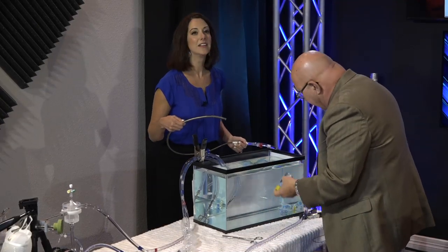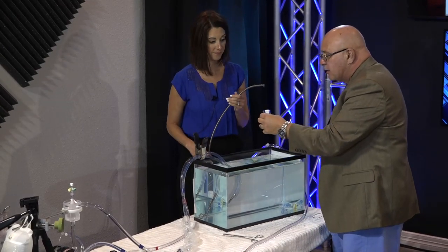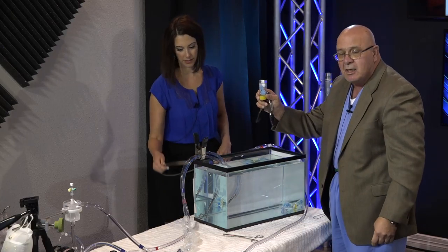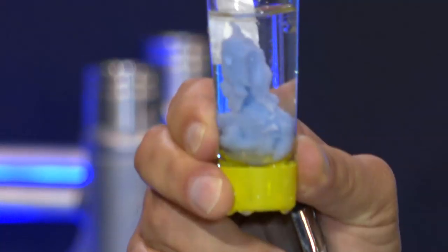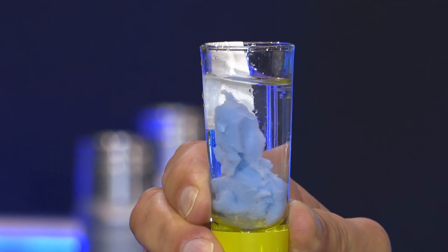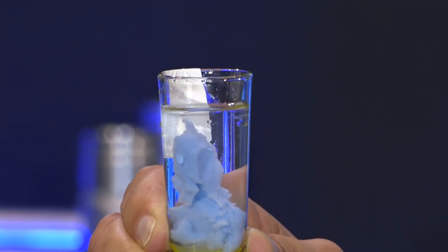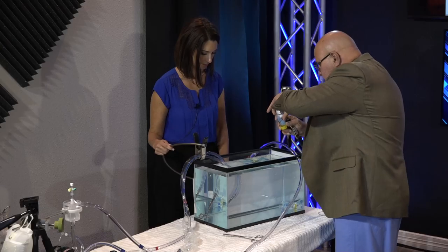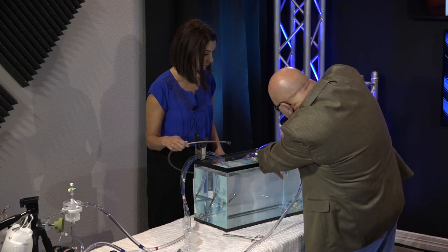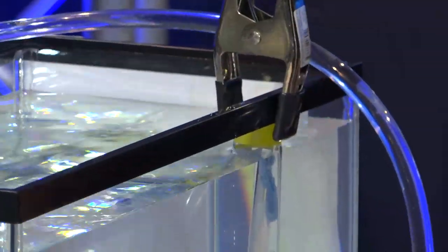Okay. What I have in here is a clot. This clot is going to represent somewhere in the neighborhood, take a look at that right there, that's definitely more than 2 centimeters. About a 10 centimeter long iliac thrombus that ended up breaking off from the iliac, going up into the RV and out into the PA, and now you've got it blocked, okay? Right. So I'm going to attach this to here, like this, and get my little towel.